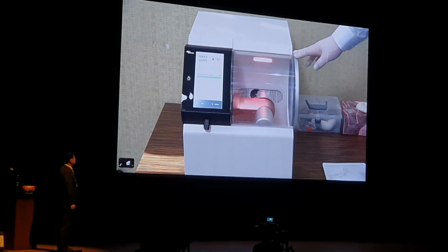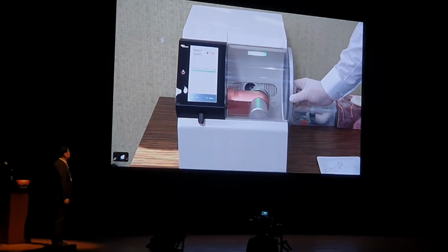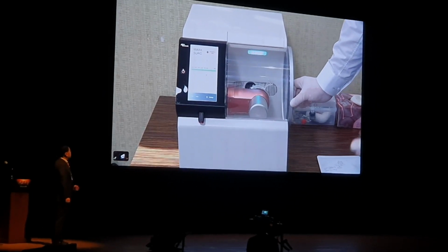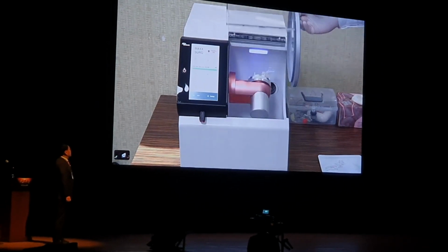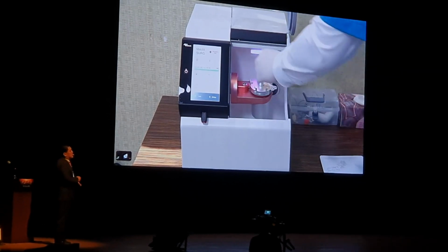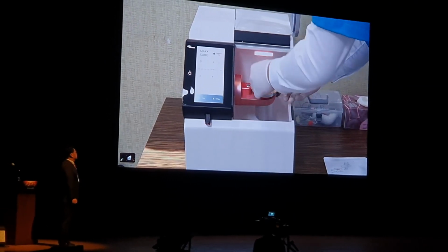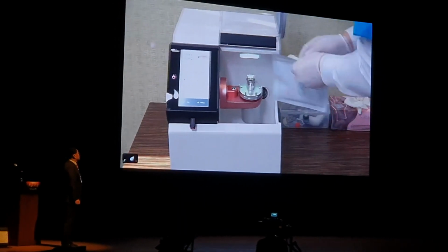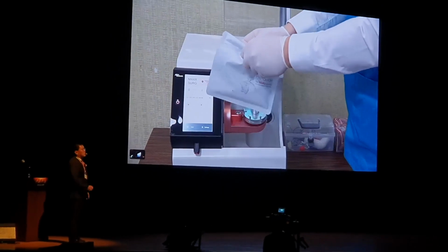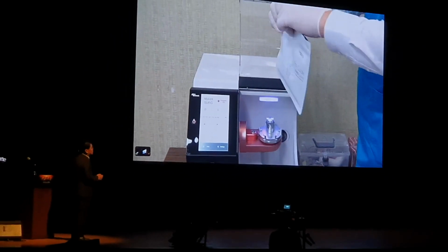Okay, everybody ready? So alright, could you put the milling on screen? The milling process is just being completed, and we are taking the index pre-guide out of the machine. Put it inside the package. So inserting the pre-guide into the antiseptic solution until we use it for the surgery. We'll keep it inside the solution.